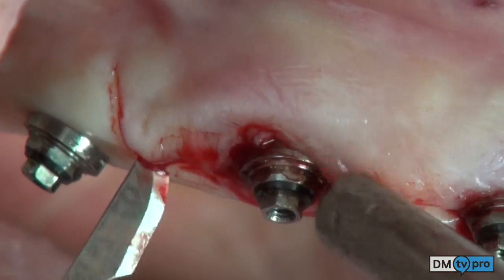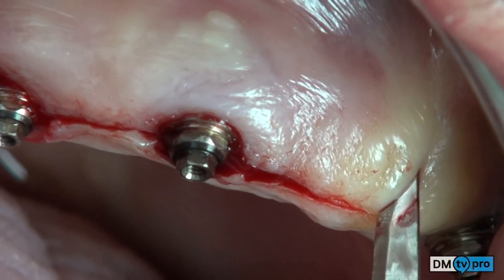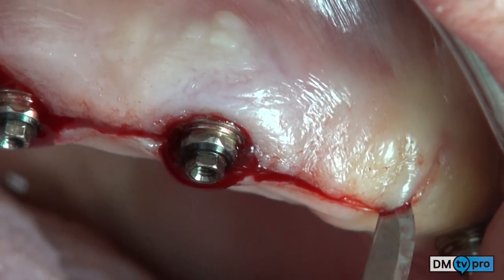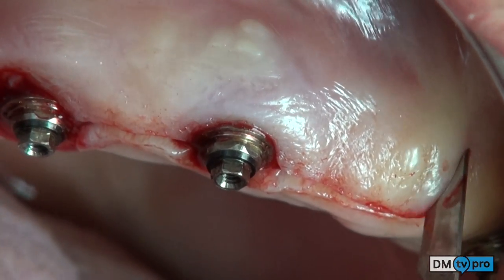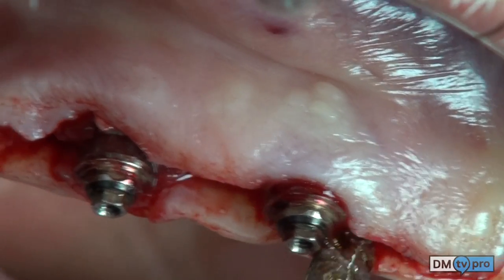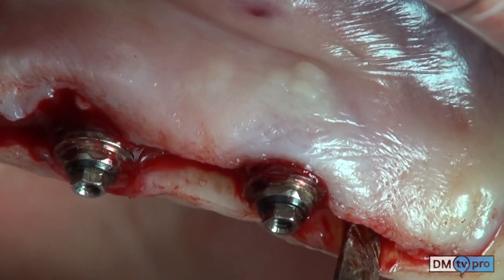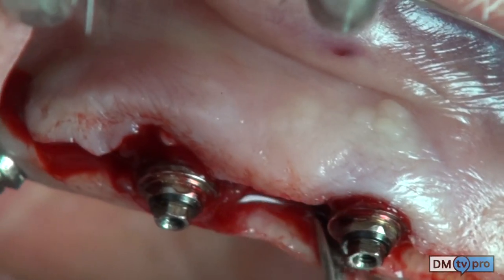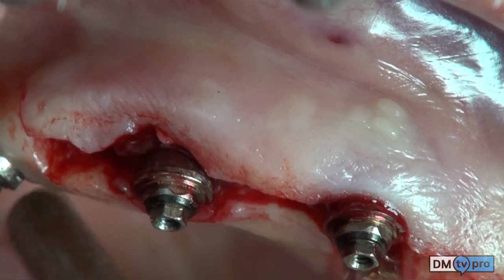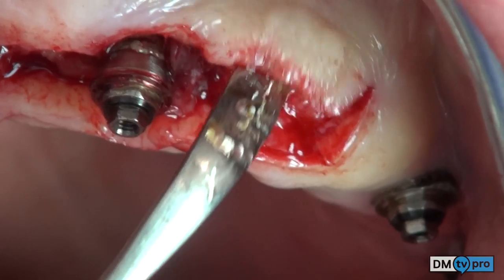With a periosteal elevator, the flap elevation is performed. Once the buccal flap is elevated with a full-thickness elevation, the two defects are exposed.